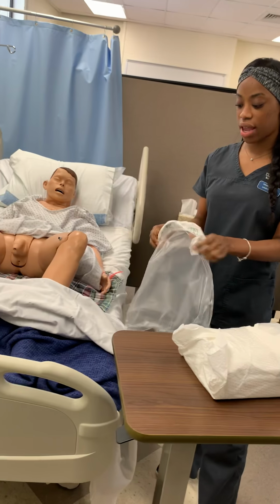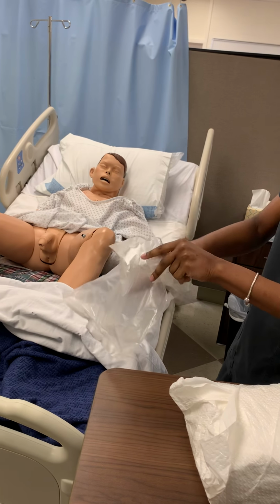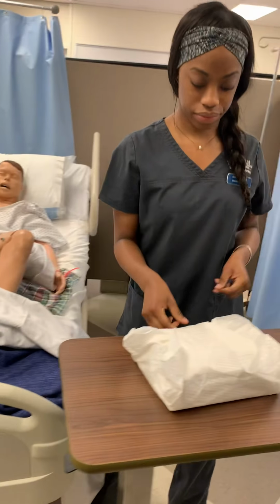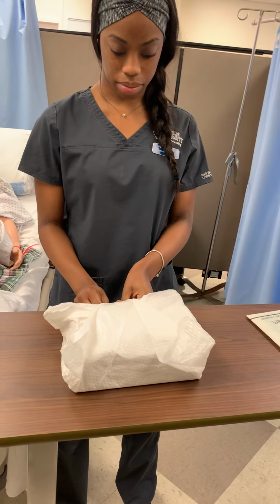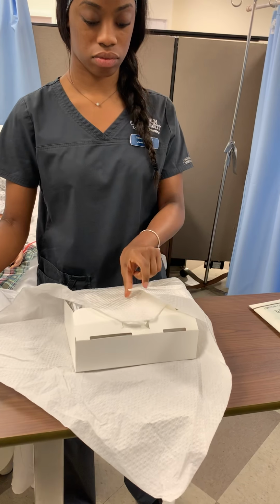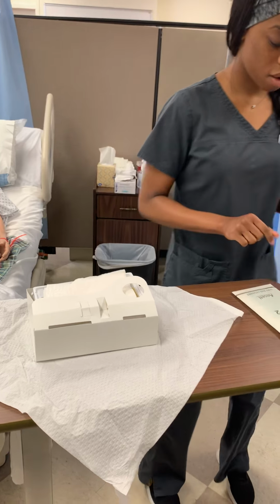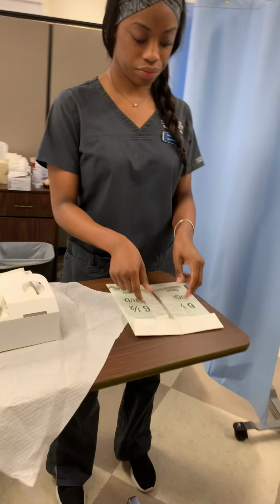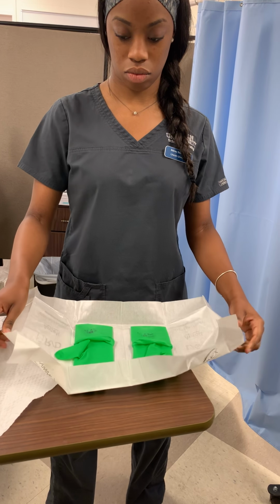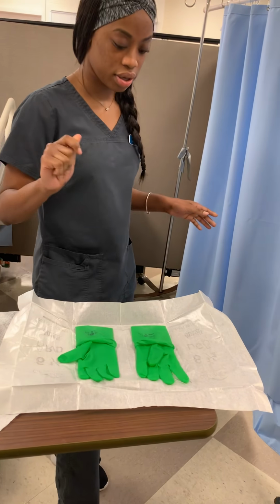This will be my little trash can for anything I need to throw away. I'll let the patient know that it's up under the bed so he doesn't knock it off. Now I will start the setup. All right, now I will put on my sterile gloves, dominant hand first.